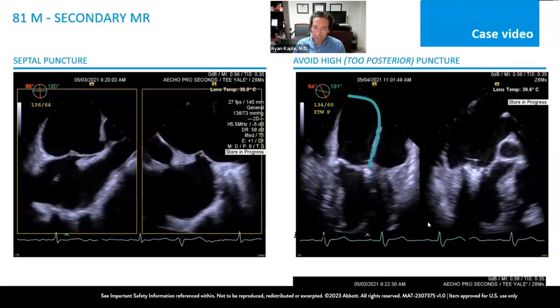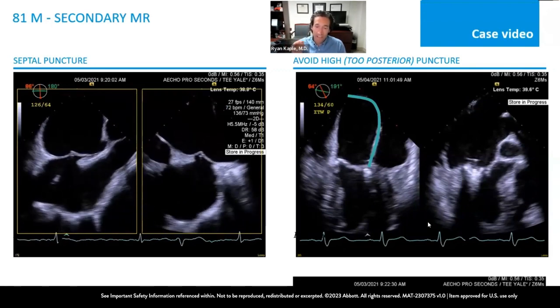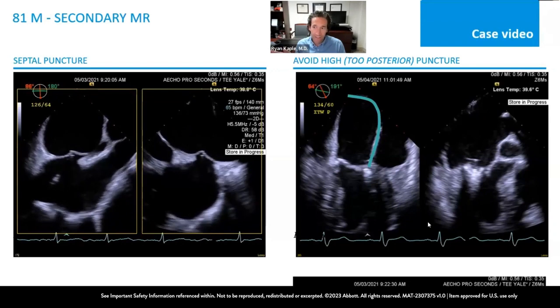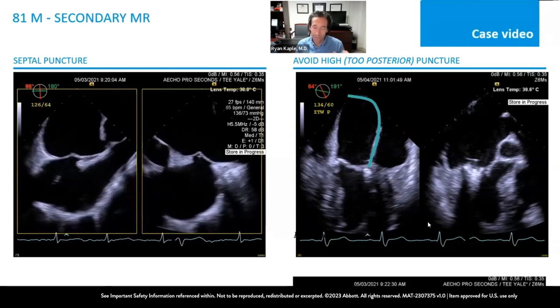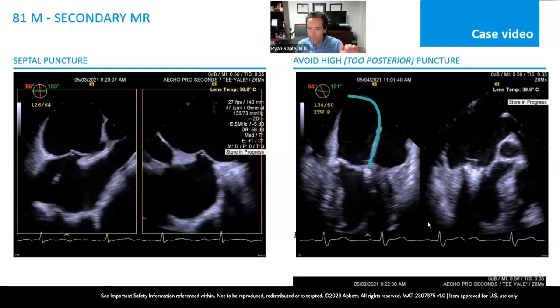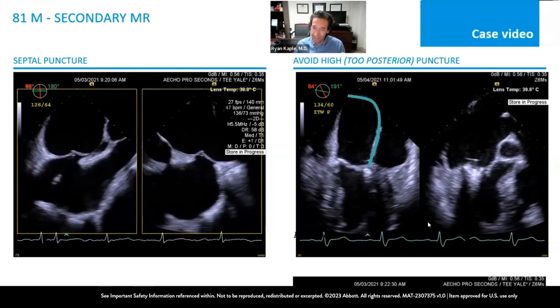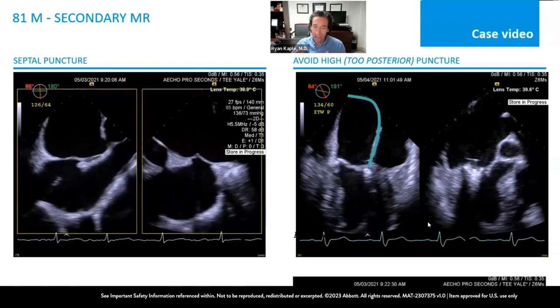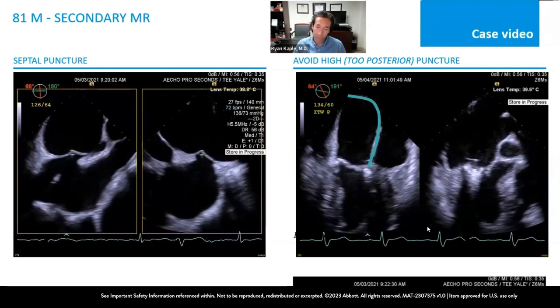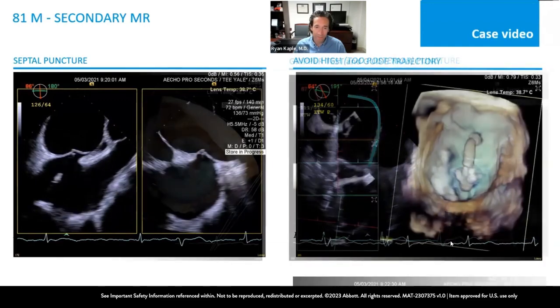Now, the other piece about the transseptal is if you're too superior, if you just barely come out of the SVC, that will bias you towards the anterior leaflet. And this relationship between the vena cava and the anterior and posterior leaflets is really important. So if you're mid-septum, it gives you the most room posteriorly, but it also should drop you down right at midway between in the AP dimension, if you will. And so right over the coaptation line, not biasing you towards the anterior leaflet or the posterior, because then you may be sweeping across and have an aorta hugger or the opposite when you're coming down towards the leaflets.